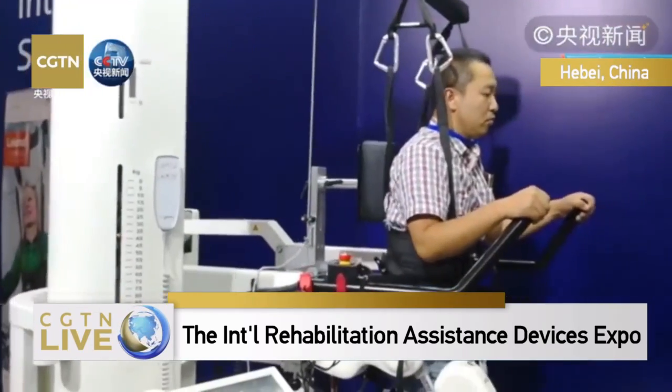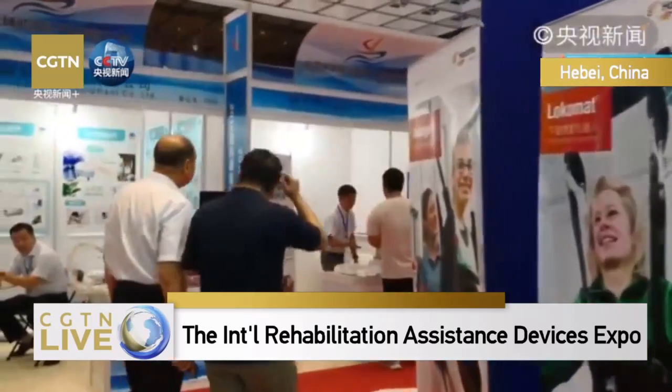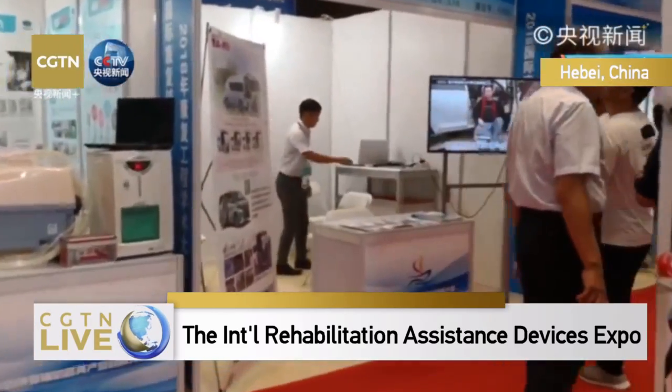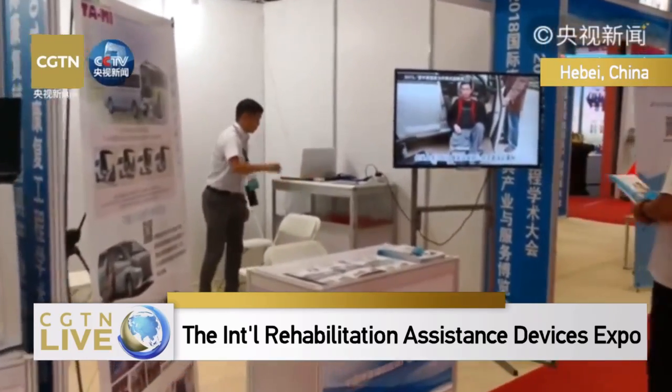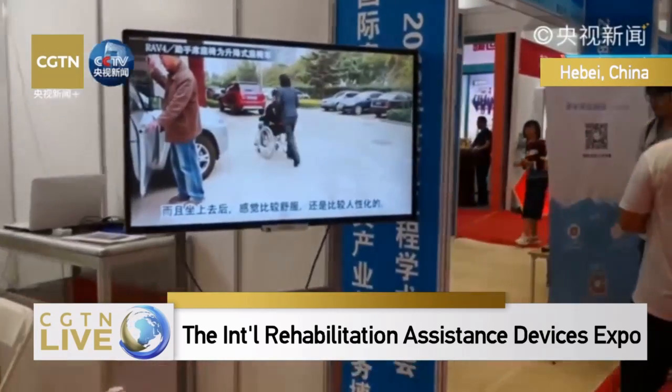Thank you so much. I believe that this is quite useful when it comes to the restoration of walking and standing capability of a patient. You have already become an expert.